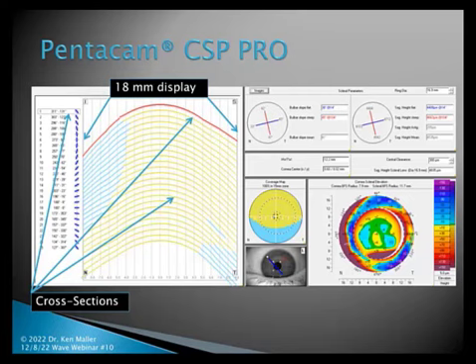That is full capture. The coverage map tells you how much coverage you've actually been able to obtain, and you can see that it's filled in with a yellowish green color on the top, and a turquoise color on the bottom. That's indicating that I actually took 2 scans to get the entire display.